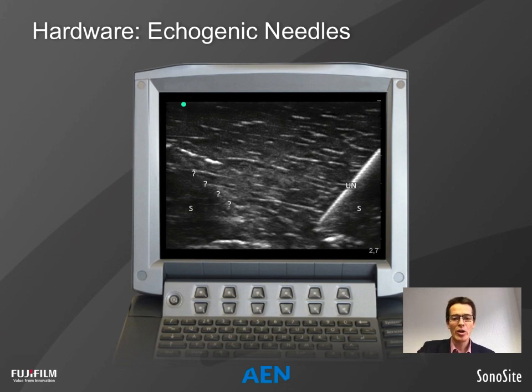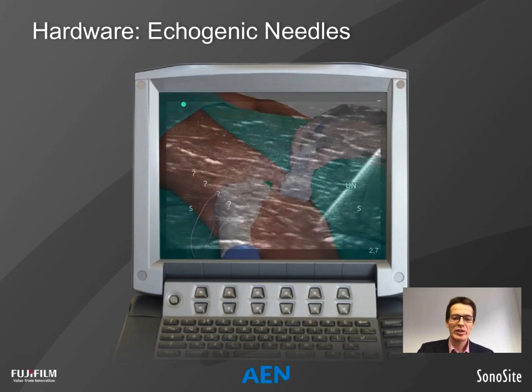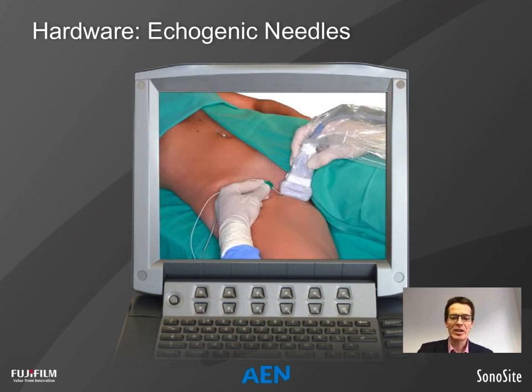So there are no reflections of the needle shaft back to the probe, but because the needle is perfectly placed in the center of the scanning plane, it creates a shadow below the needle. So you only have an indirect vision of this needle. Whenever you have very steep puncture angles, or you work very close to vulnerable structures like the pleura, why not use an echogenic needle?